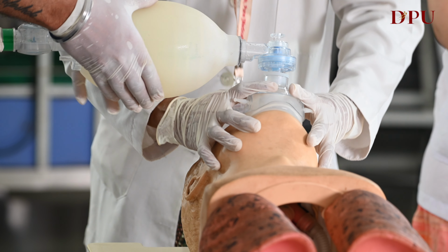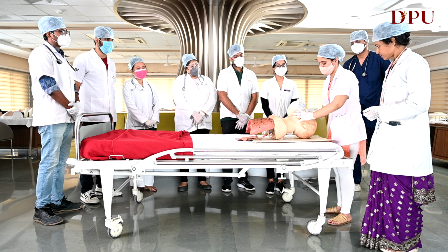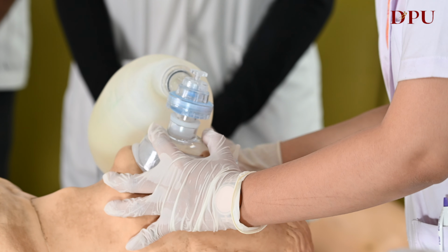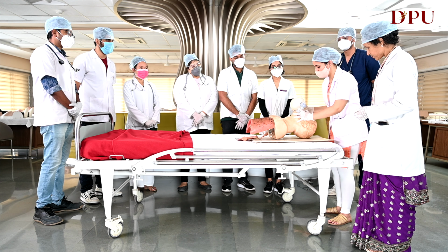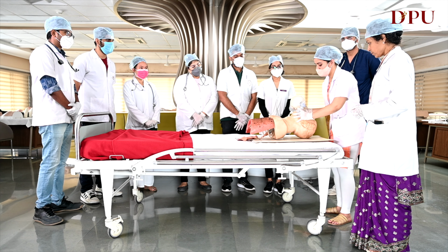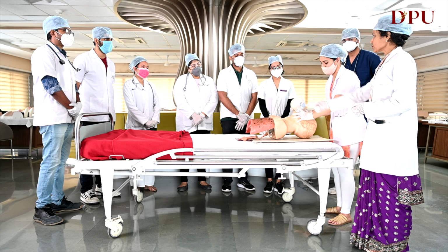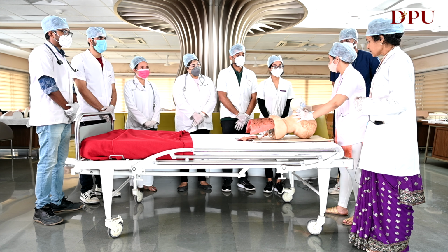You understood? I want each one of you to practice. First, this is the C to prevent any leakage, and this is the E for jaw thrust. Very good. 1 1000, 2 1000, 3 1000, 4 1000, 5 1000, 6 1000. Very good. 1 1000, 2 1000, 3 1000, 4 1000, 5 1000, 6 1000, breath. Excellent. So we are getting a good chest rise. So successful. Yes, sir. Next person.